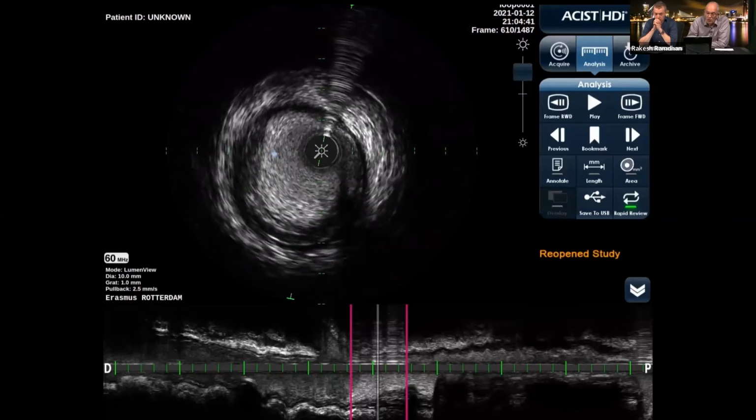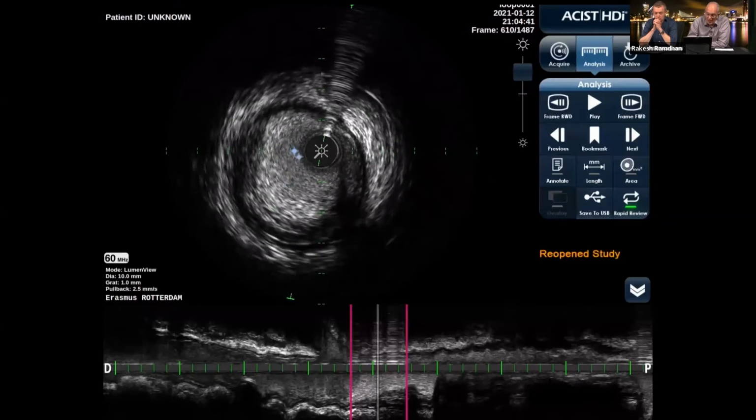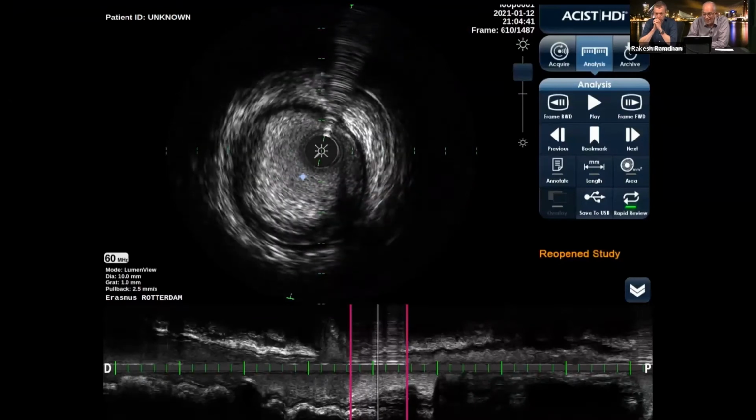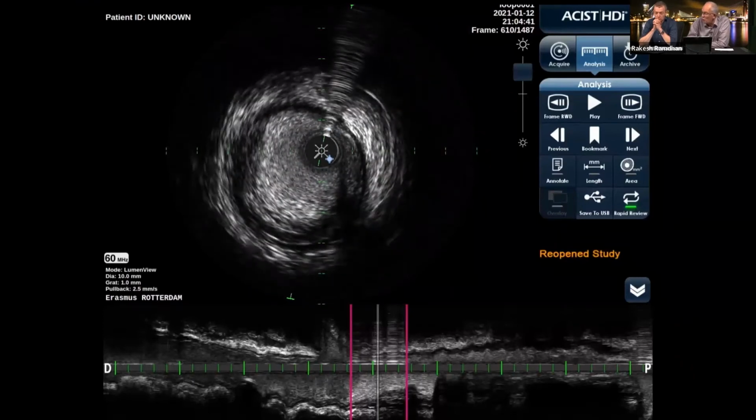The only difference between non-moving blood and acute thrombus is that acute thrombus will be against the wall, and you see normal blood flow in between. That's the difference, and for ultrasound, it doesn't matter if it's non-moving blood or platelet aggregation, the first sign of thrombus. Well, non-moving blood here gives an indication that somewhere proximal, the IVUS catheter is occluding the vessel. That's why we do not have any flow.